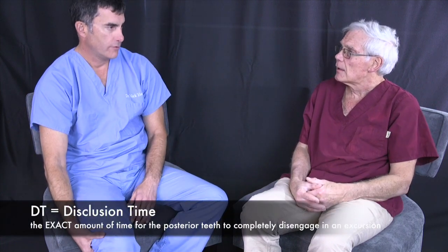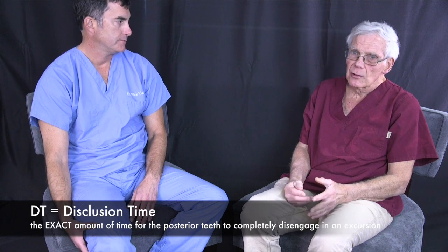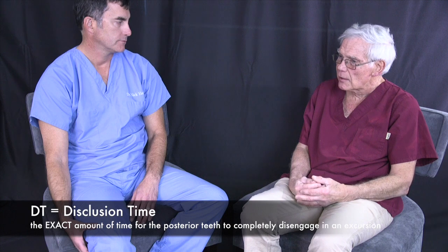Yes. But it might also produce a distension, like for instance, a thin articulating paper is deflected by the cheek or tongue. Sure. And the thinnest articulating ribbon, we're talking in the 20 micron range. That's about the thinnest they have. And you're looking at ink, which does nothing to track force, nothing to track time. And I think that's key. Don't you agree that the timing is probably the most important thing we get out of the T-Scan? Timing is, although DTR, disclusion time reduction, is deemed extremely important for muscular conditions that are excessive.